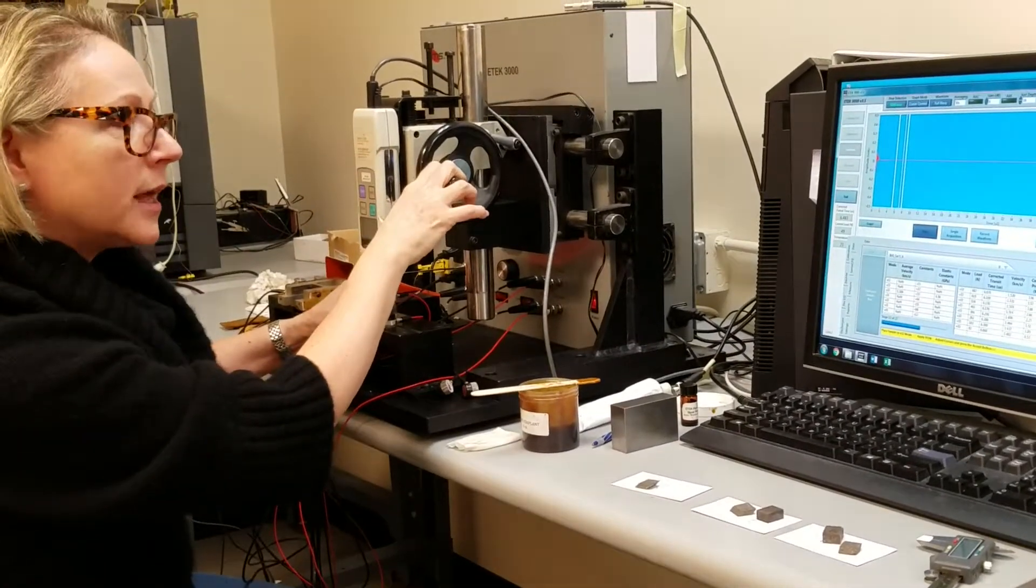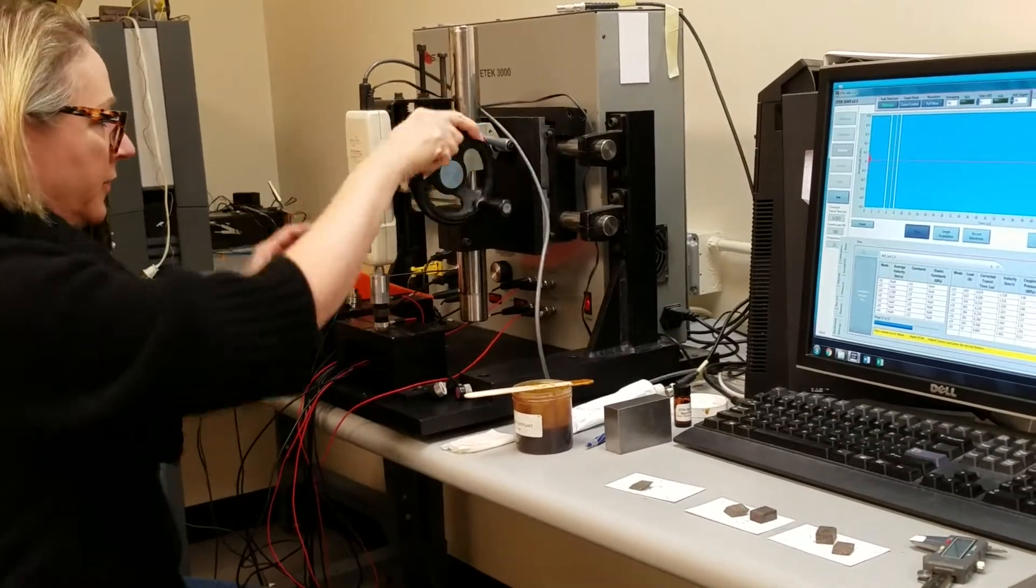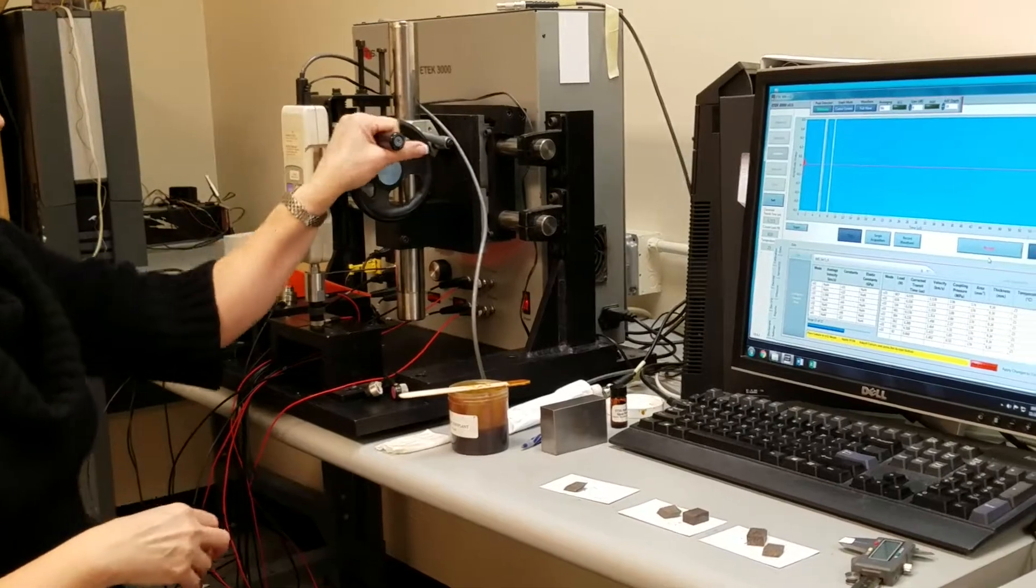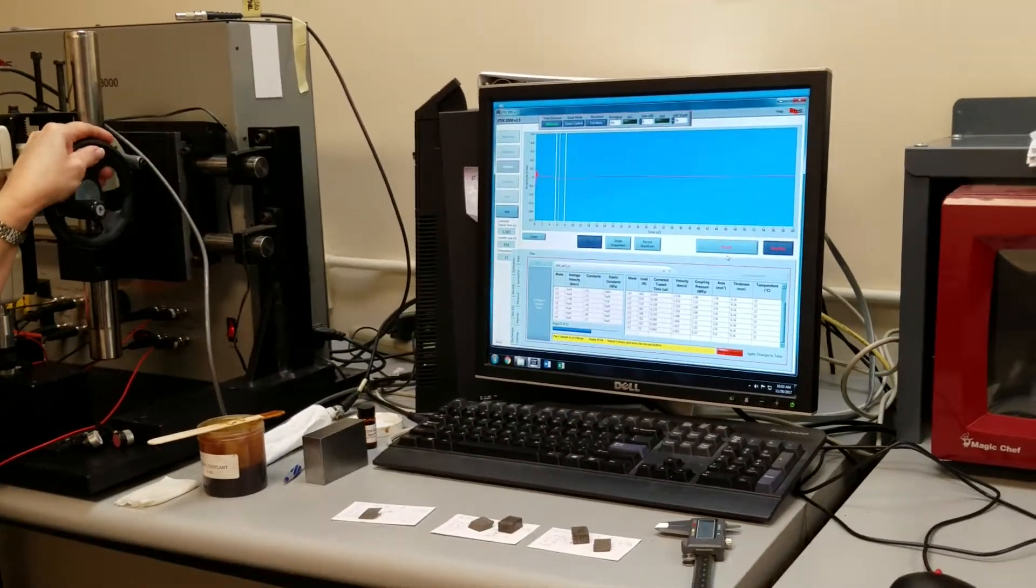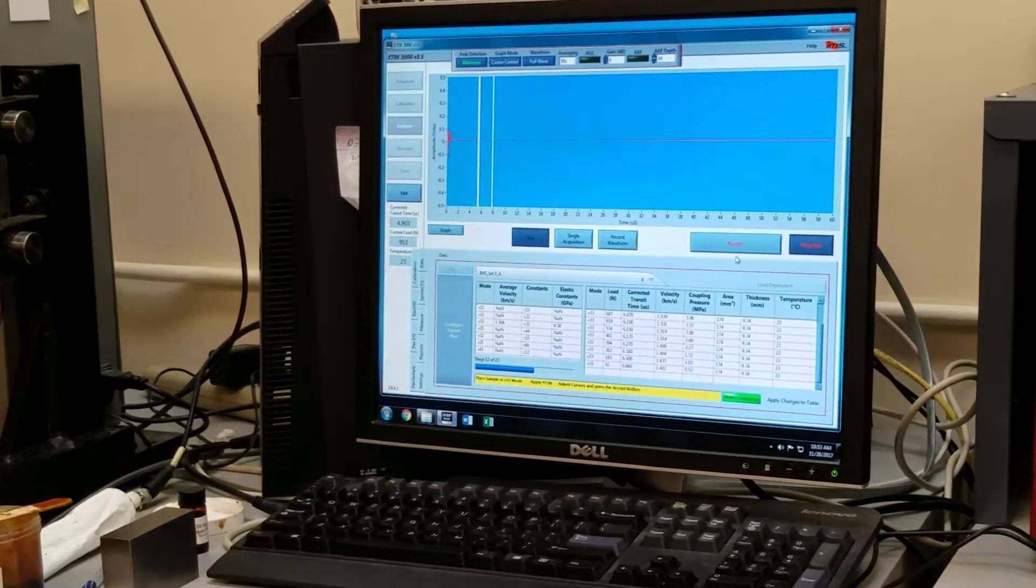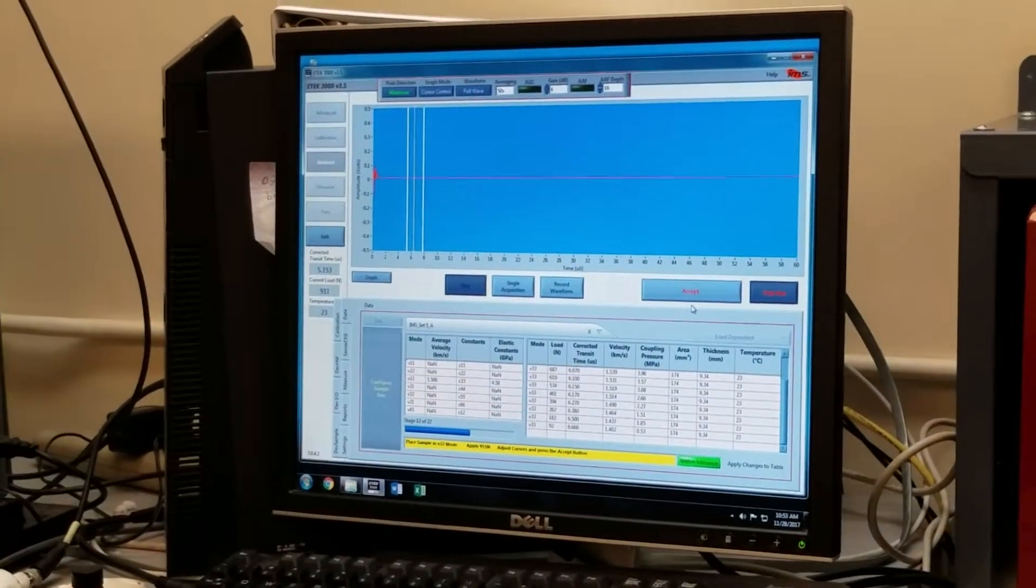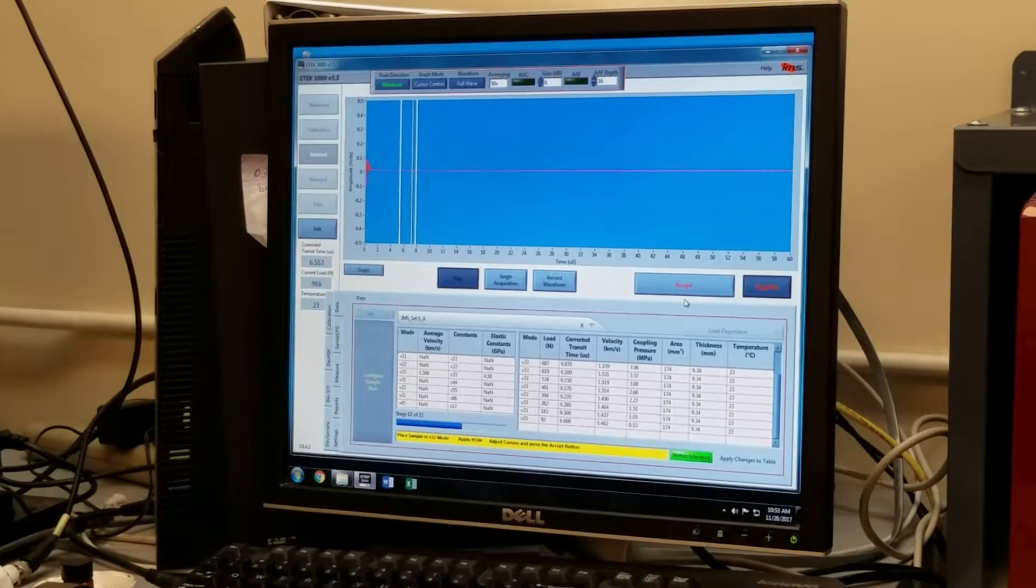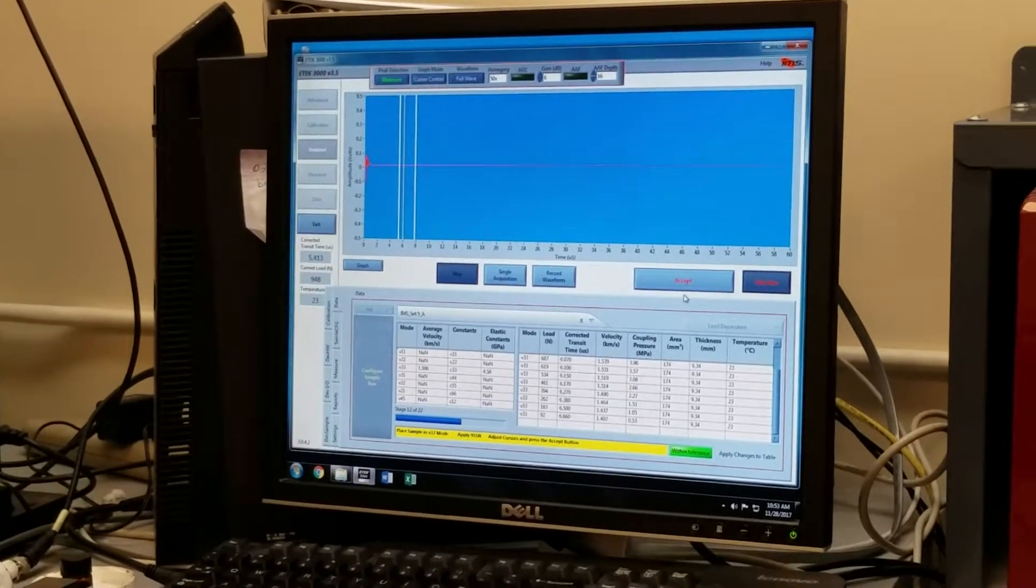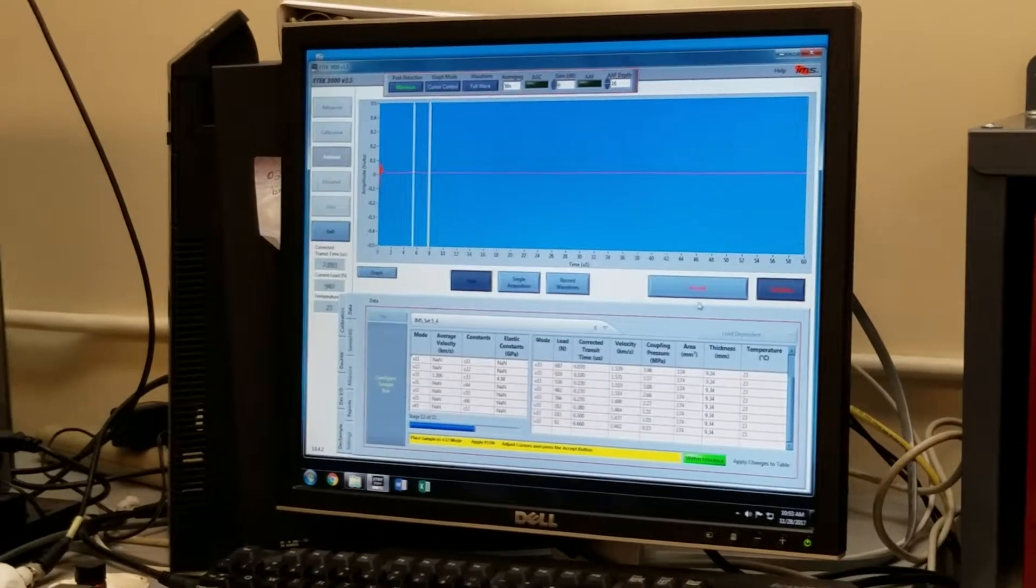And the prompt says apply 955 newtons, and the loads will be the same as we measured with the compressional transducers. The biggest difference here is going to be that we're going to measure a trough and not a peak.